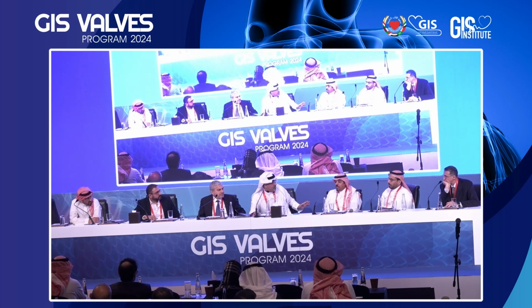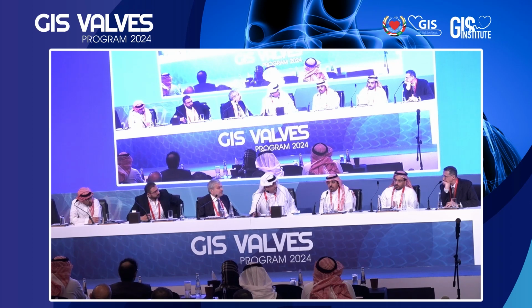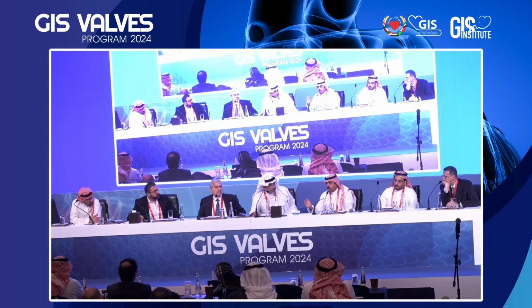No balloon sizing? No balloon sizing. I think we have robust data with CT-guided assessment, and it is enough to use that to guide you. Once you use sequential ballooning, then it becomes a subjective assessment. This is what I think; your colleague may disagree.